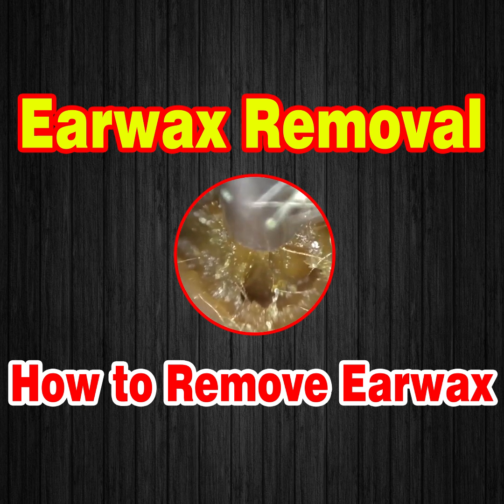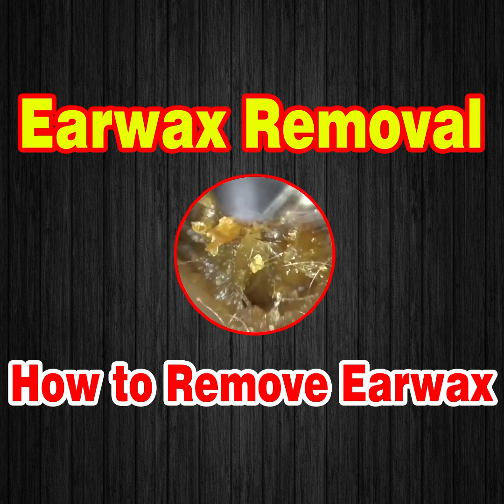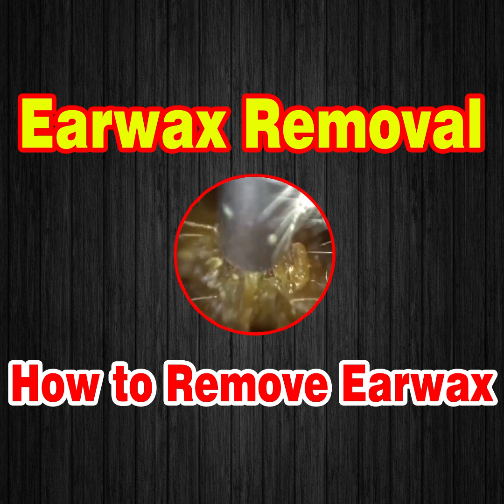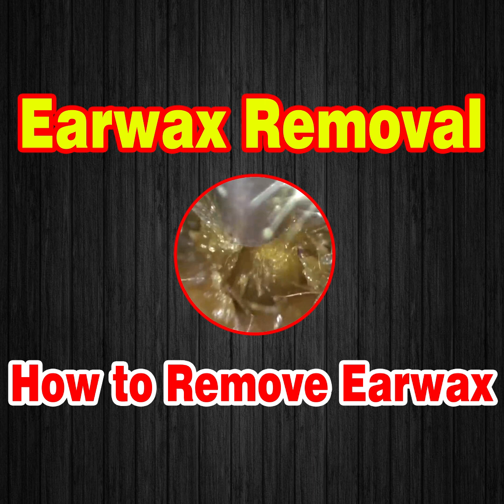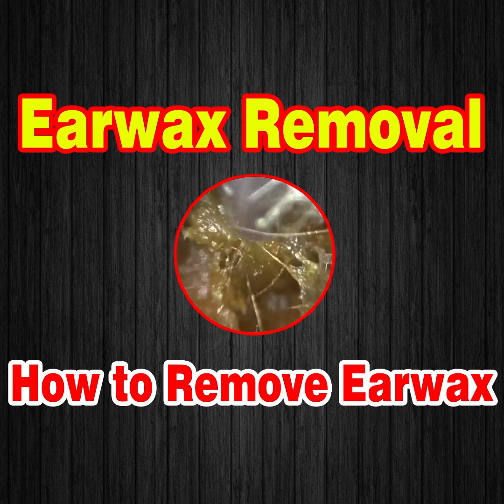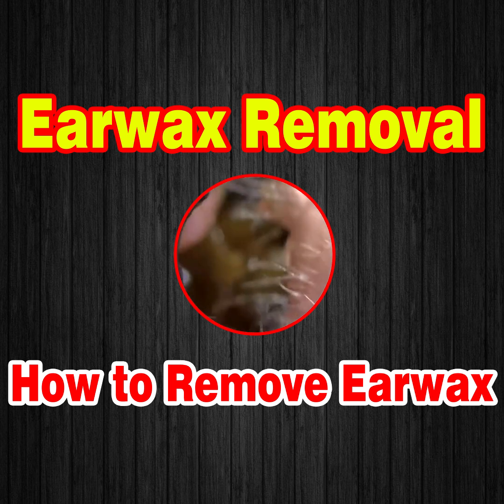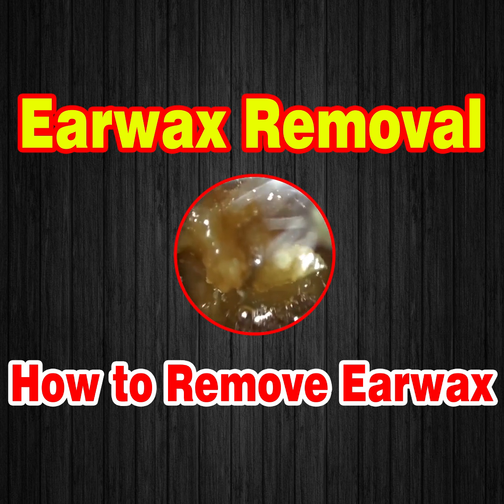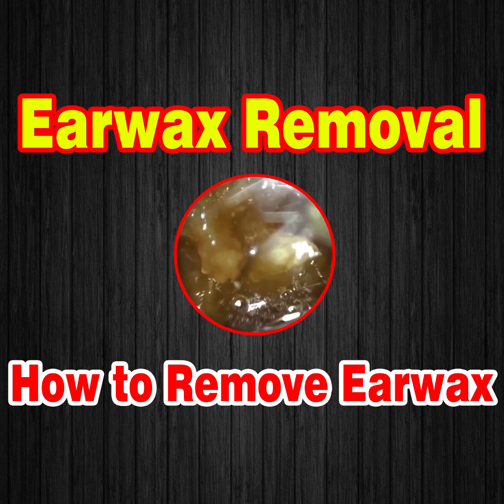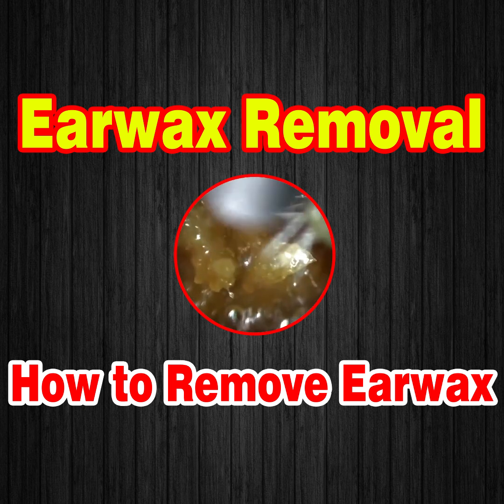They do report that area being quite itchy, and it's just on the underside of the tragus cartilage, so it's right at the entrance. So, a bit of a backstory, this patient just suffered from chronic wax infection. They travelled a distance to visit myself actually yesterday, and their previous experience elsewhere was extremely uncomfortable to the point where the patient had to ask the specialist to stop the procedure. So we had to bear that in mind.